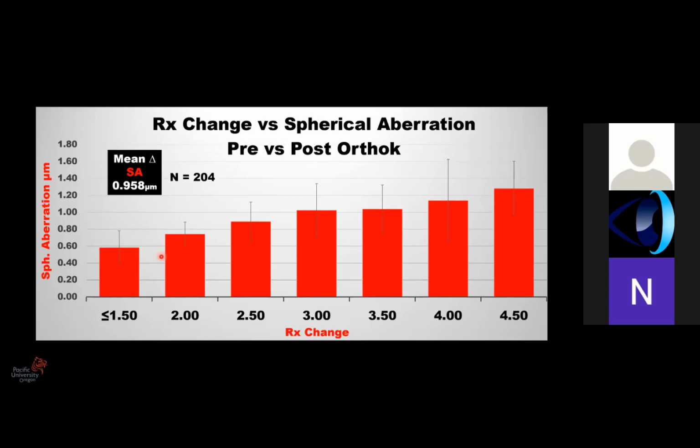To my knowledge, there isn't a single study that has really teased this out, as Steve said. Unless we're actually looking at these cohorts definitively, I don't think we have a story. However, what we do have is the HM Pro study out of Pauline Cho's group at Hong Kong Poly that was fit on high myopes. So it was specifically the high myope group. I think her findings were that if you fit patients with at least 4 diopters of a myopic shift, if you were creating 4 diopters effect, the axial growth was in the neighborhood of 58% less. So her study showed you got slightly better axial control using Ortho K on high myopes specifically.